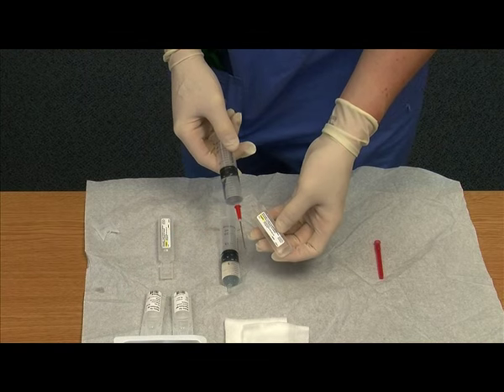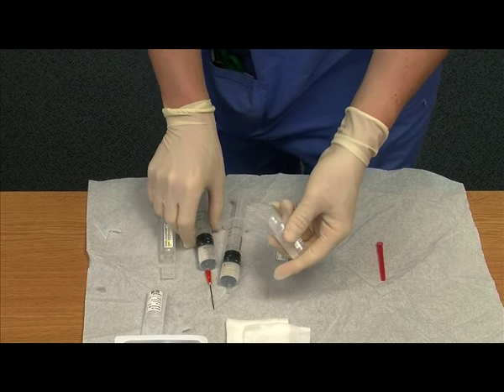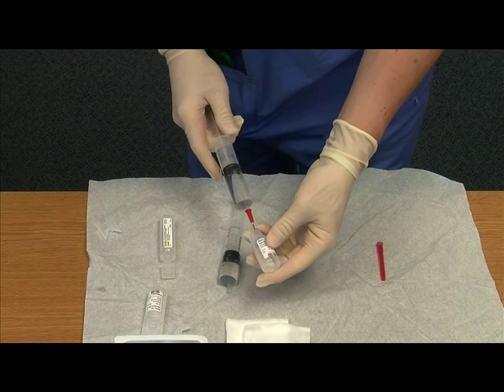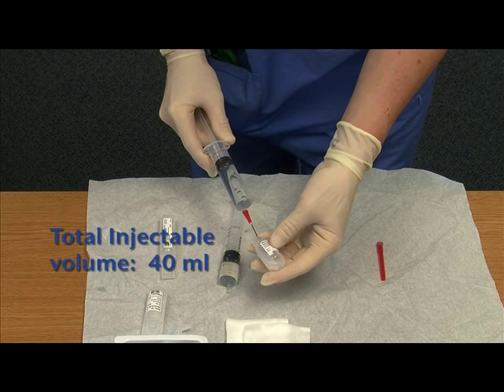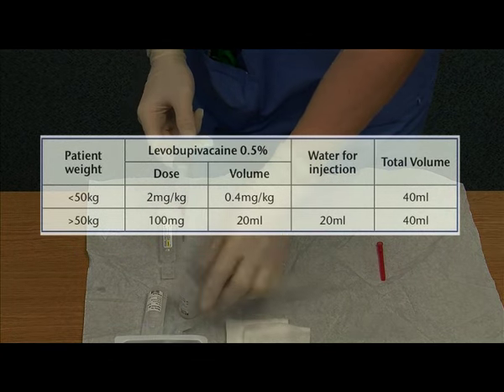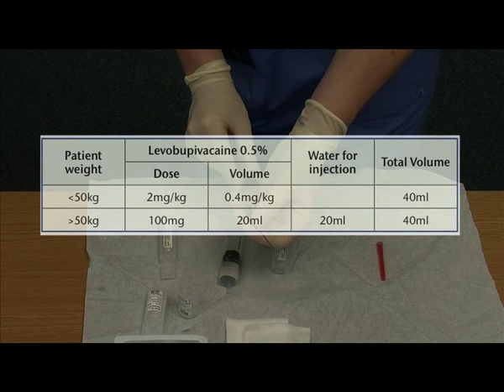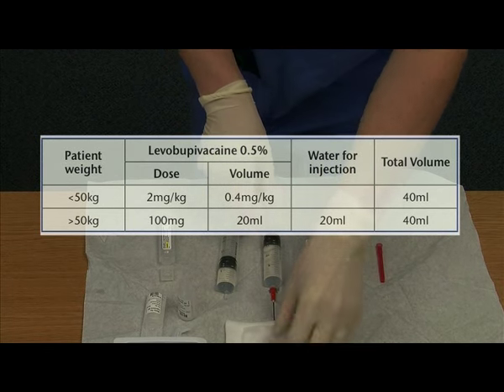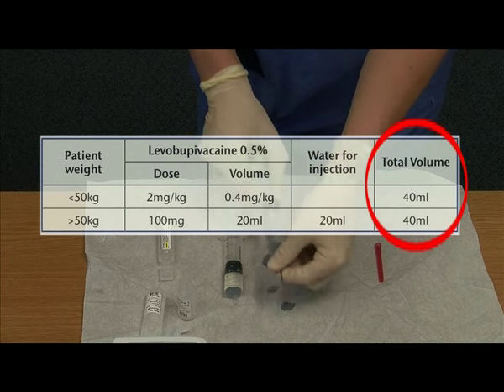Meanwhile, prepare the fascia iliaca compartment block injection using two 20ml syringes with equal volumes of levobupivacaine — in this case chirocaine 5mg per ml — diluted with water for injection. In our emergency department, we use 100mg of levobupivacaine for patients over 50kg and calculate the dose on an individual basis for those patients less than 50kg. No matter what dose is used, ensure the total injectable volume is diluted to 40ml.